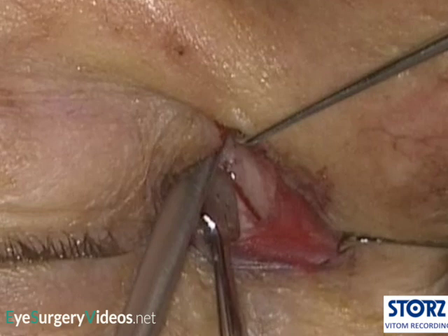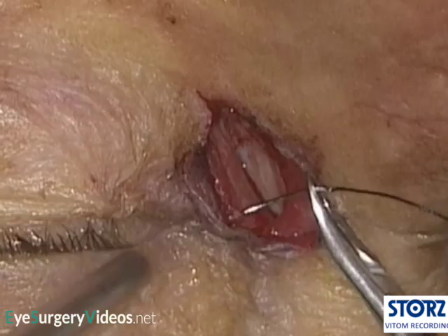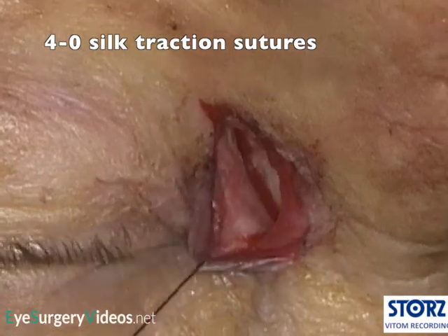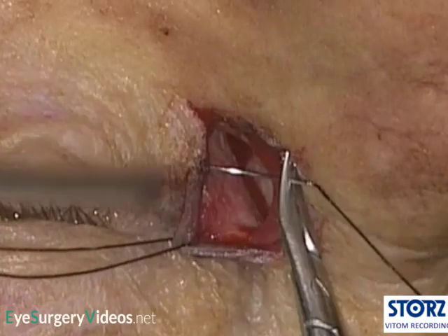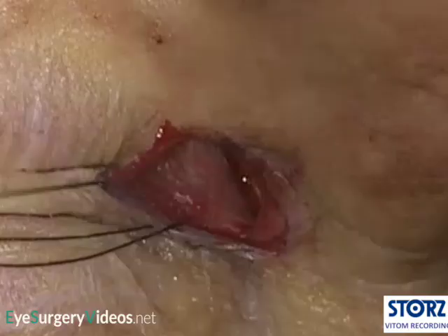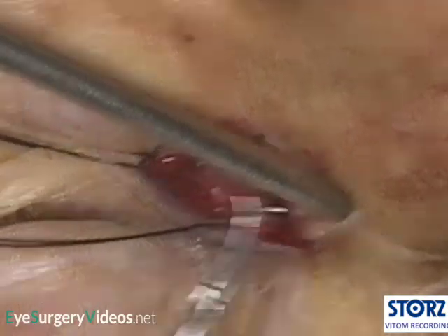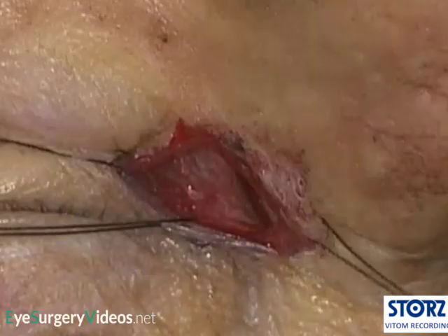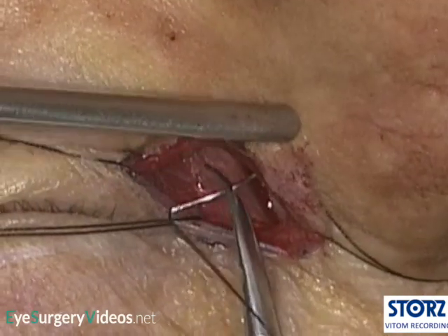Posteriorly, the periosteum separates easily from the lacrimal fossa and lifts the lacrimal sac out of the fossa with it, but care is taken not to penetrate the lacrimal sac, as the end of the elevator is quite sharp. Traction sutures are very helpful, although not essential. Two silk 4-0 sutures on each side of the incision, spaced at thirds along each edge, will maximize exposure.